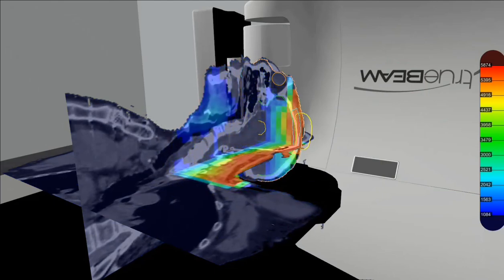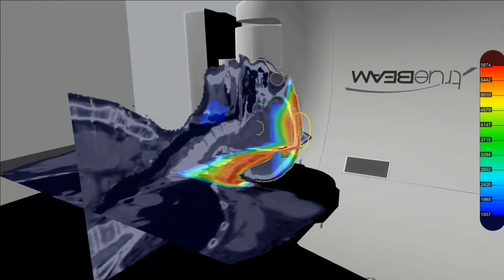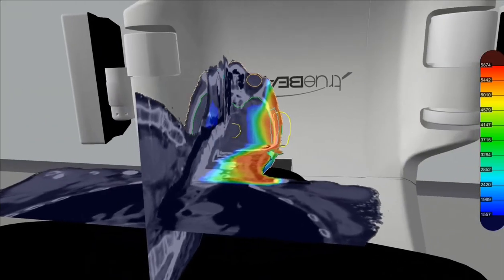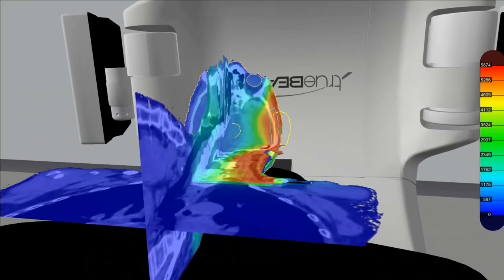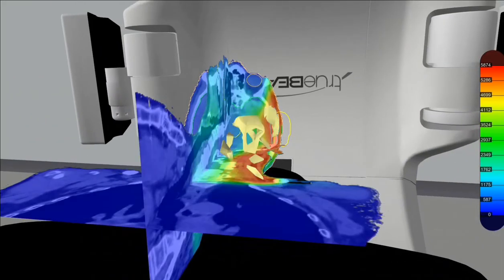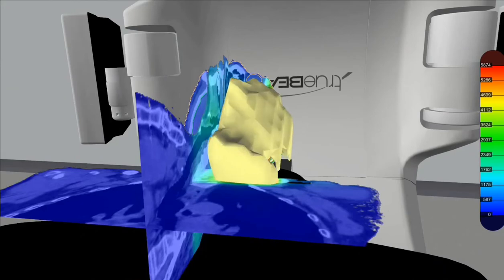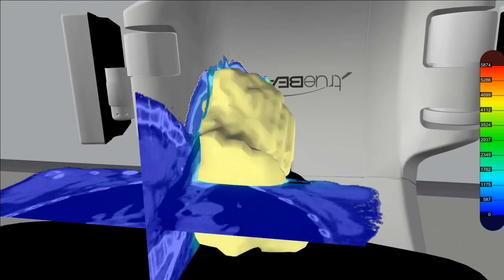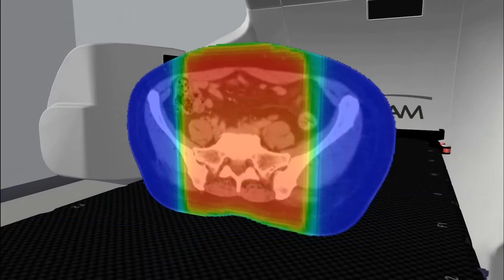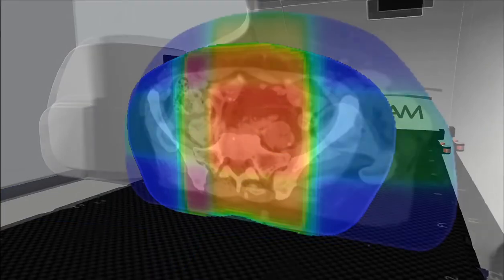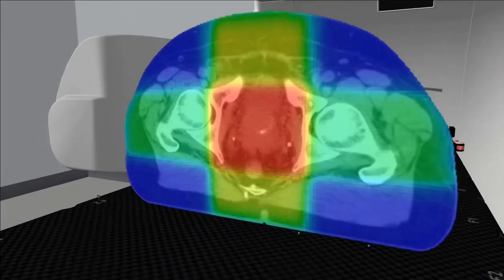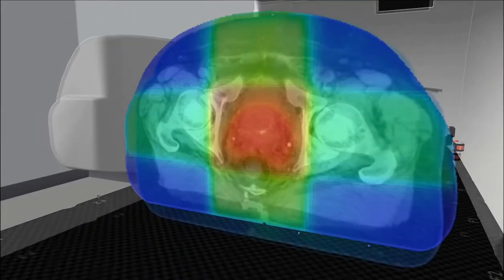Dose displays can be adjusted to allow for a clear visualisation of low dose baths or hotspots, highlighting the characteristics of each plan and the differences between techniques such as a parallel opposed pair, a four-field brick, or a VMAT plan.